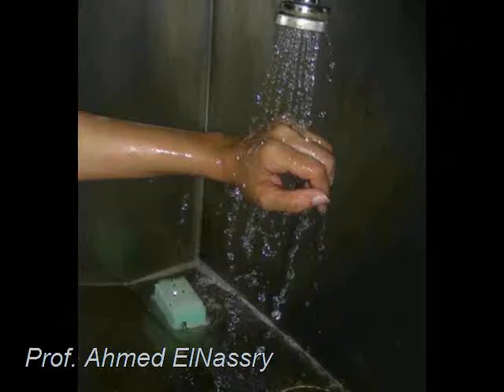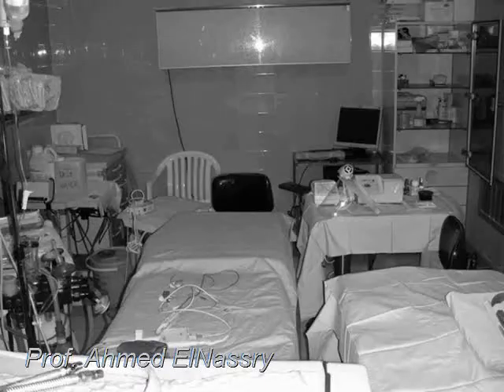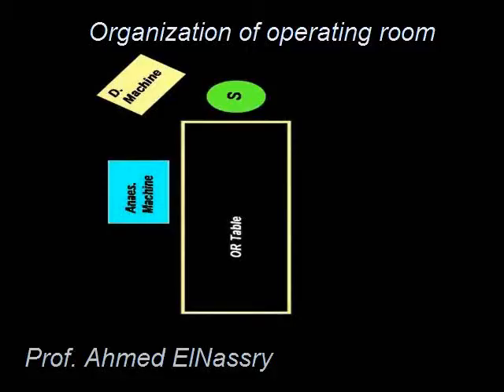After hand washing and wearing the surgical gown and gloves, they will demonstrate the protocol. Before we enter the operating room, we must have an idea about how we are going to organize ourselves inside the room. Our operating room is rectangular in shape, so we are going to use the one-side assistant method.